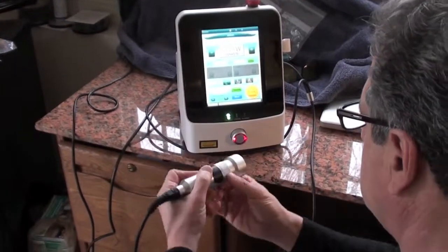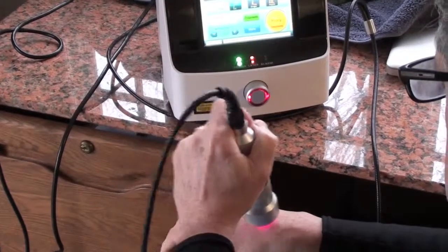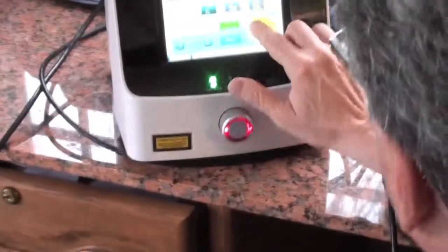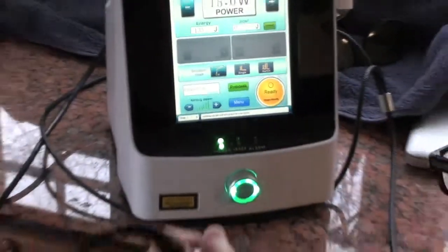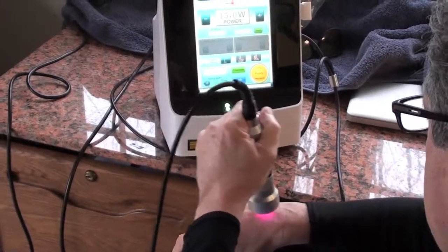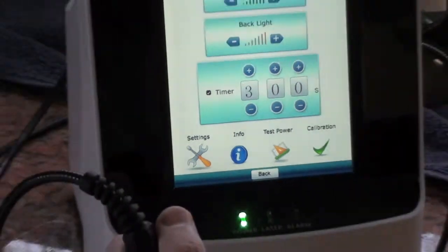You see the beam. And you turn it, you press it. Now you notice that this is running with the switch not being held. Watch this. If I unhook the timer, go back, ready, let's see what happens. See, it won't work. You have to hold it in. So you must have the check off. Always checked off. And that's what controls the switch.